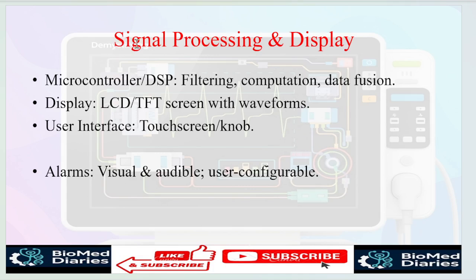This is simply the DSP, digital signal processing, where a microcontroller will compute the filtering, computation, data fusion, as well as display on the LCD display, TFT screen with waveforms like 8 waveform, 6 waveform, as well as interfaces like touch screen or knob screen.